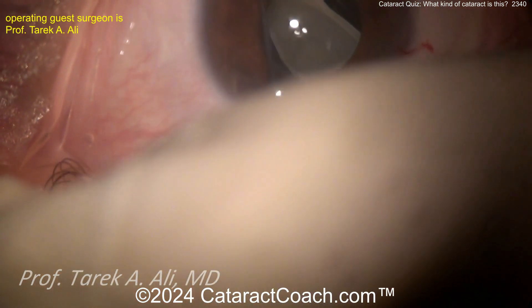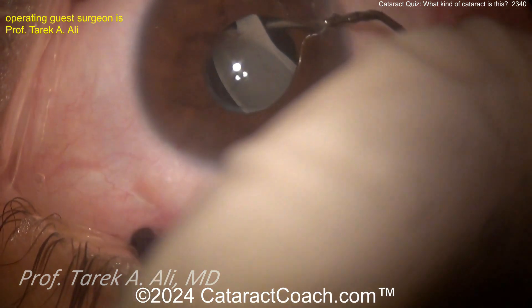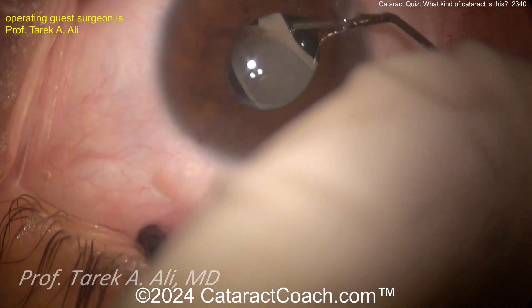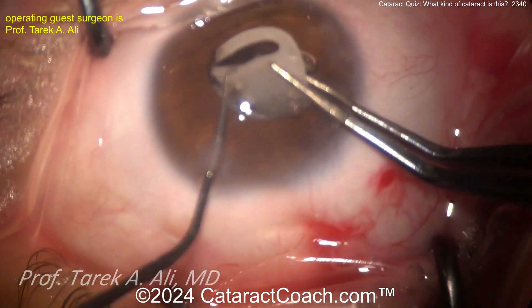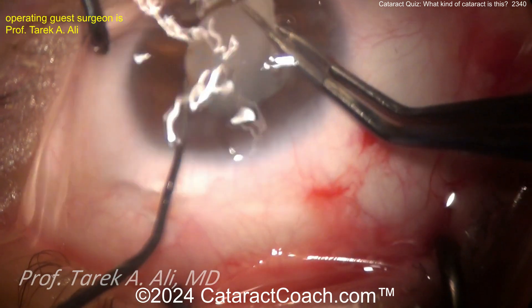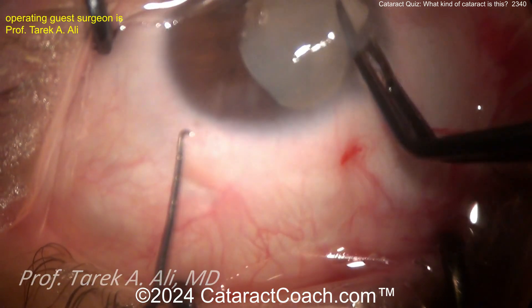I like a little viscodissection first. That got my blood pressure and pulse quite up! Getting this up — there's the viscoelastic, that's what we want. Because you don't know if the patient's already had a YAG capsulotomy, I like this just to hold it, make sure it doesn't fall back. Bringing that whole lens up into the anterior segment, the anterior chamber of the eye — there it is.